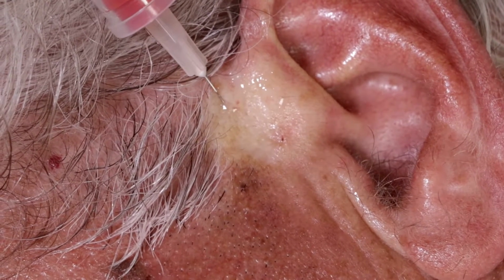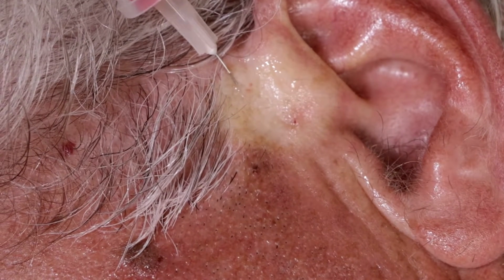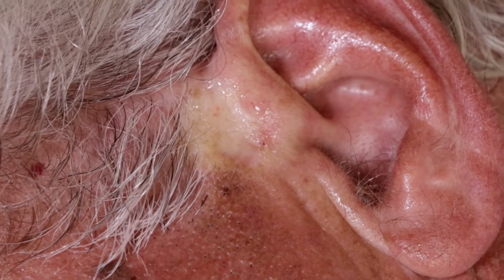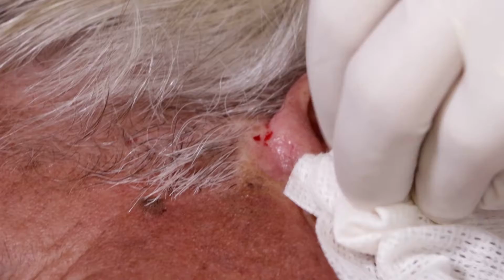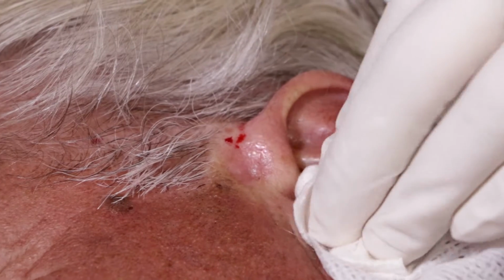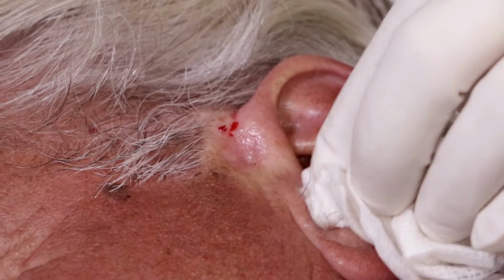Do you still feel it? No, not really. All right. I'd tell you what, it was really strange when I left here last time, though, because my ear was numb. Yeah. And hearing things, it was like my equilibrium was off a little bit. It is a strange thing. Strange. So this is to keep the blood from blocking the ear, because it will bleed down into the ear canal. Oh yeah, it did exactly what you said it did.